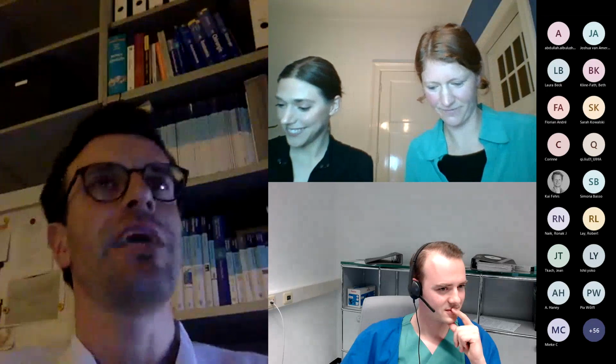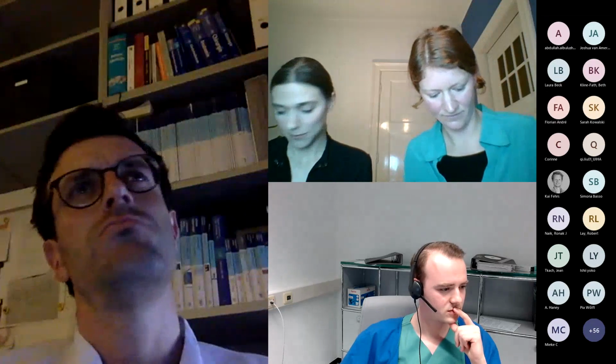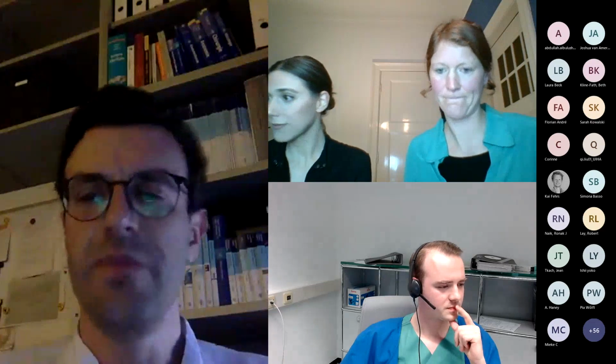Yeah, indeed. So the total time of our scan protocol should be around 15 minutes, but this is only net time, so this is acquisition time only. And as you might have realized, the real examination time is longer, because the fetus may move, and then you have to repeat the sequence. That is what we usually have to do, because we don't use sedation for the fetuses. Some institutions do this, but I think in Germany this is not possible. So sometimes you have to repeat your sequence.